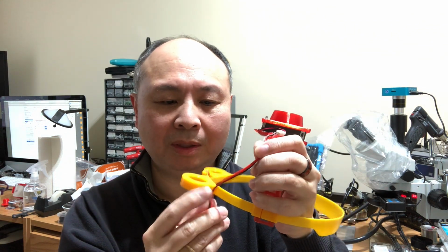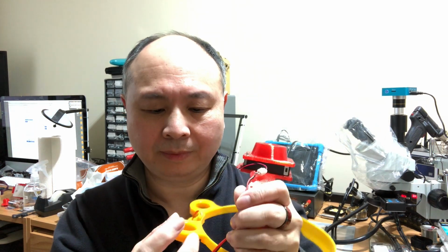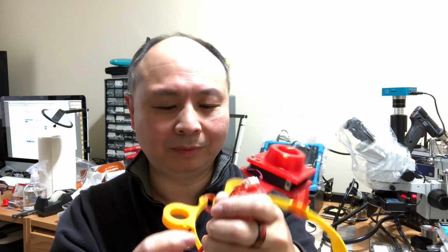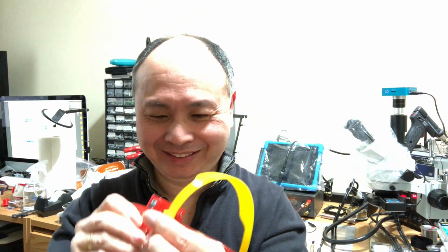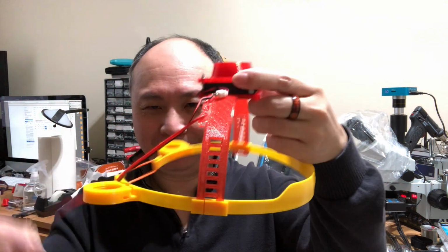We used to zip tie it here to the Halo, but now they're upside down. One second. All right, so now it's right side up, and we'll click it in place. All right, so it's in. There's the Halo. You see out the wire.